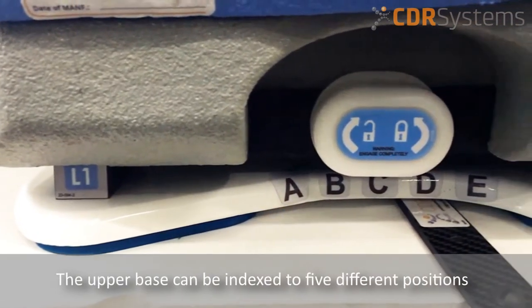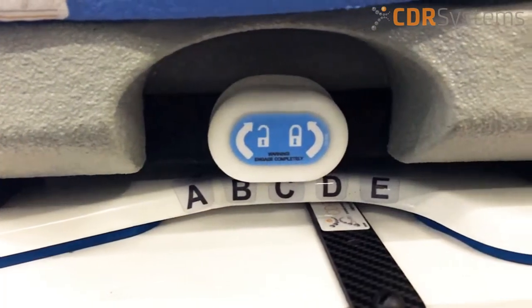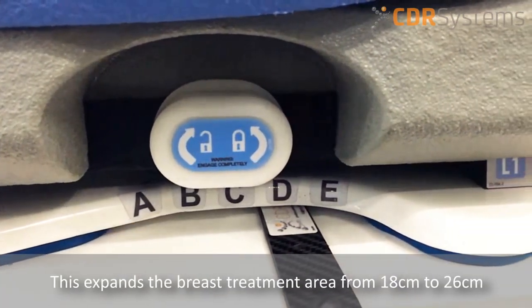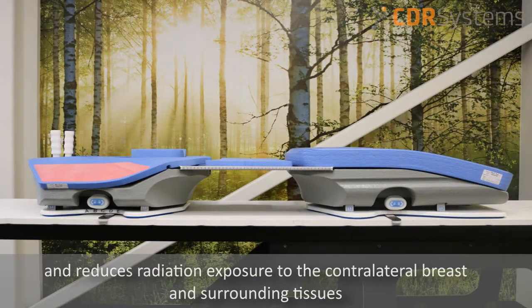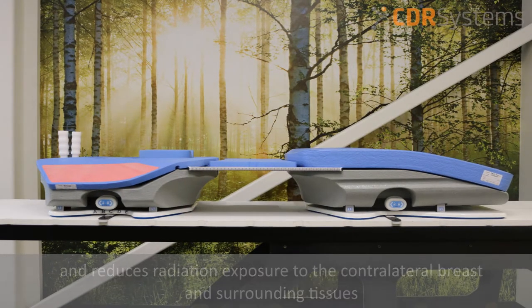The upper base can be indexed to five different positions. This expands the breast treatment area from 18 centimeters to 26 centimeters and reduces radiation exposure to the contralateral breast and surrounding tissues.